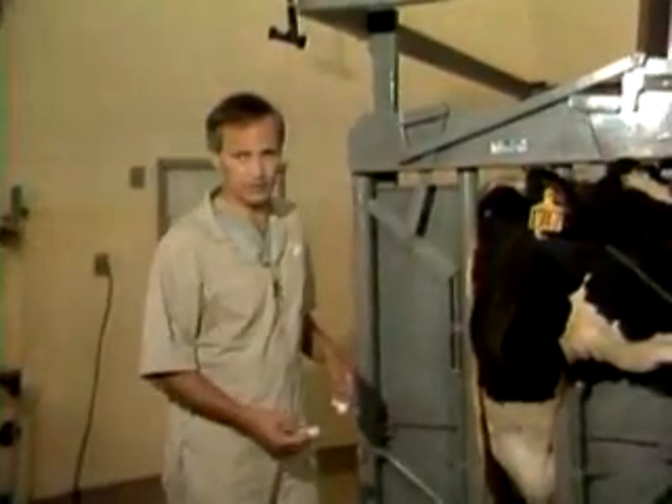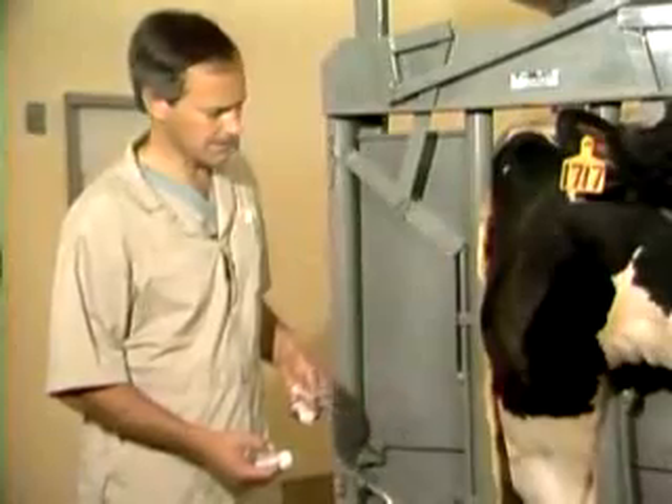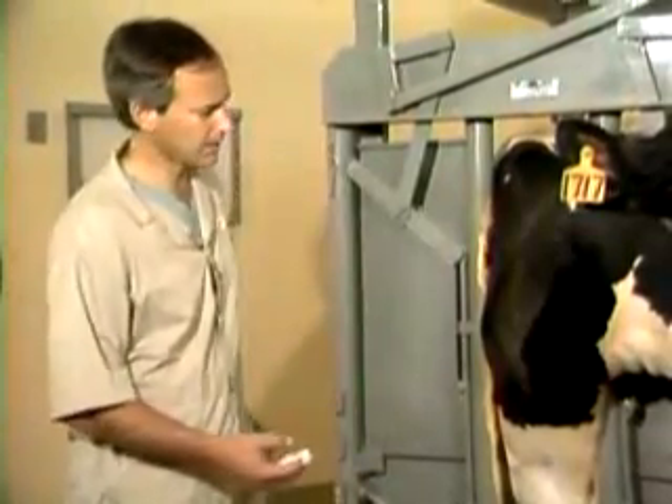Now we're going to demonstrate intravenous techniques. The first thing we're going to do is obtain a blood sample, and then we'll show administering medication.